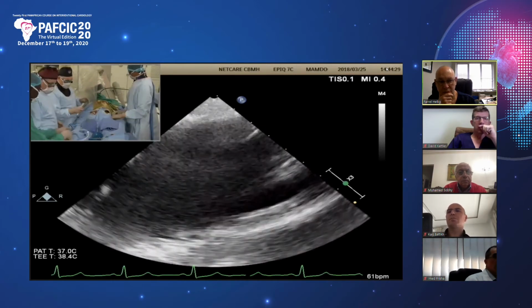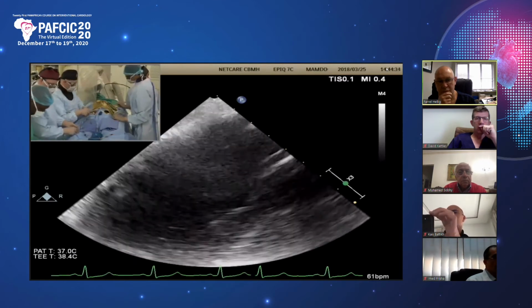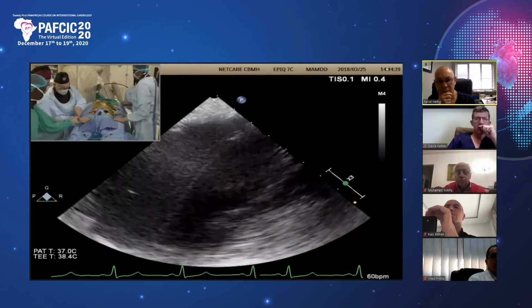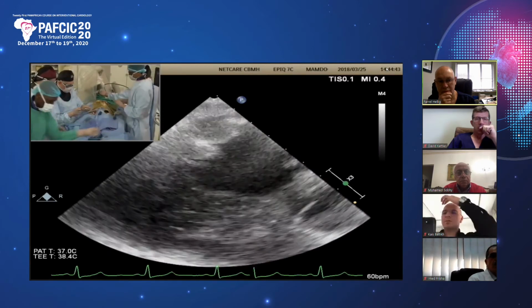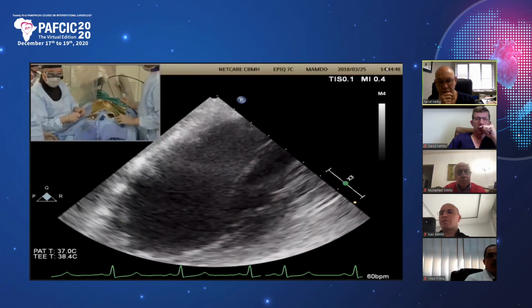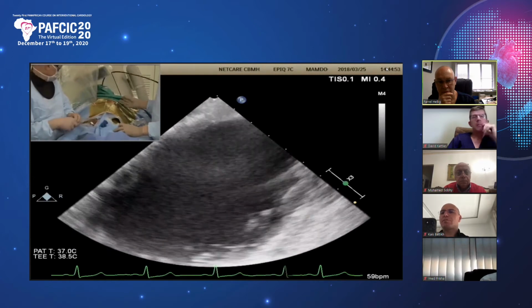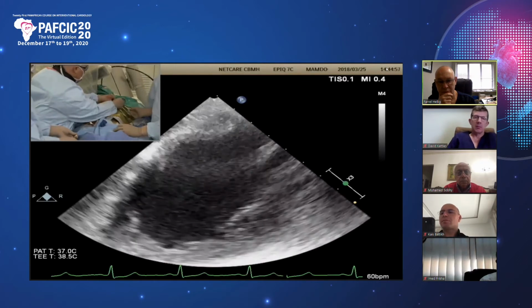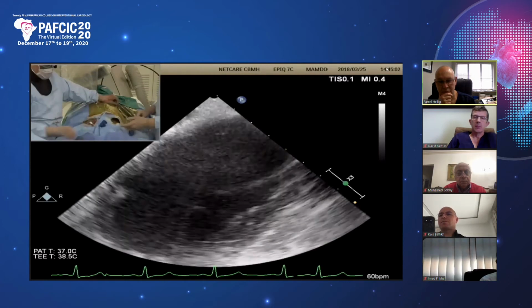And I think that this technique's particularly important. Give me the AL1, please. This technique's particularly important when you have a paraseptal leak in this medial position like we have, where it's very difficult to achieve adequate angulation and forward push of your catheters. So if we have this scenario with an exteriorized wire, we can stiffen the whole system and create the appropriate direction.